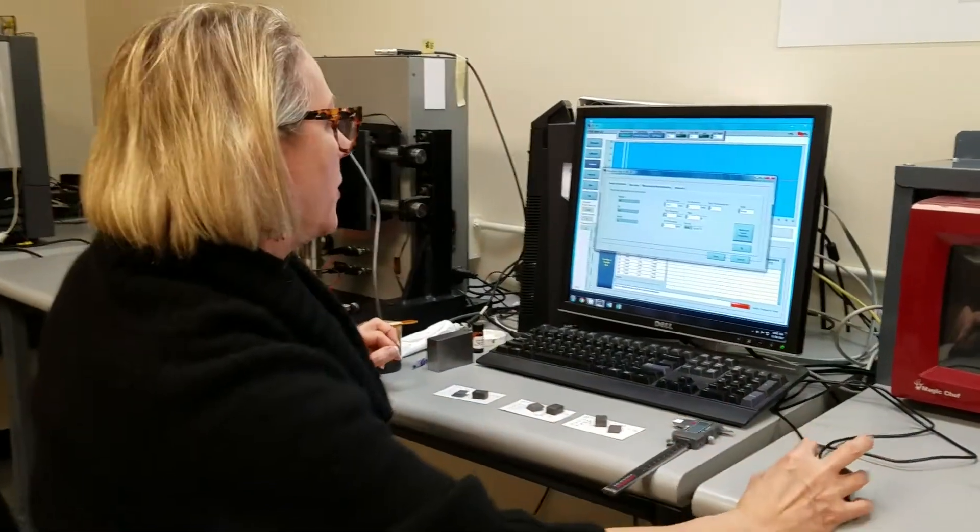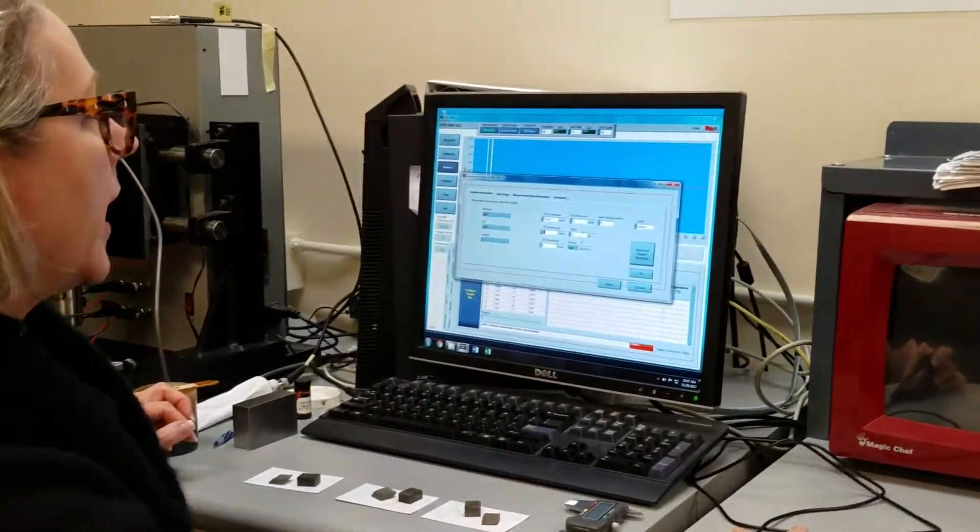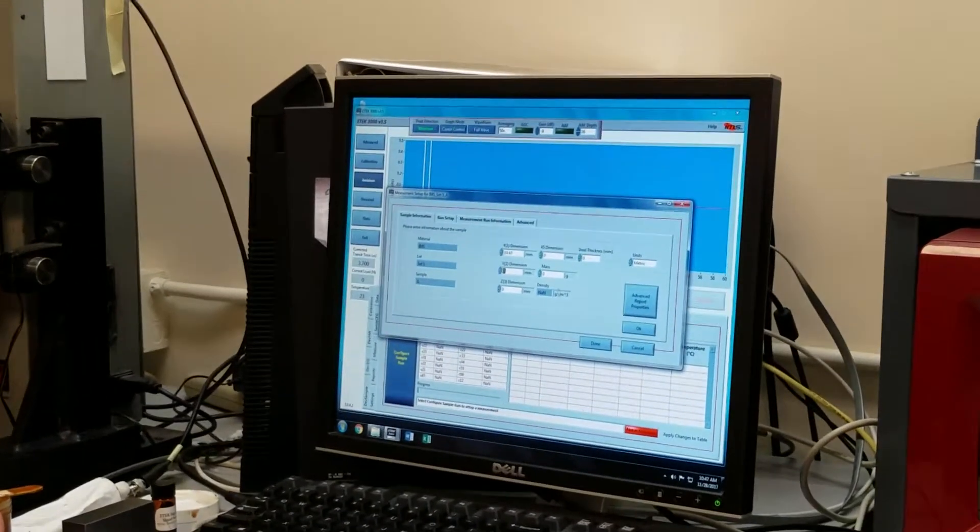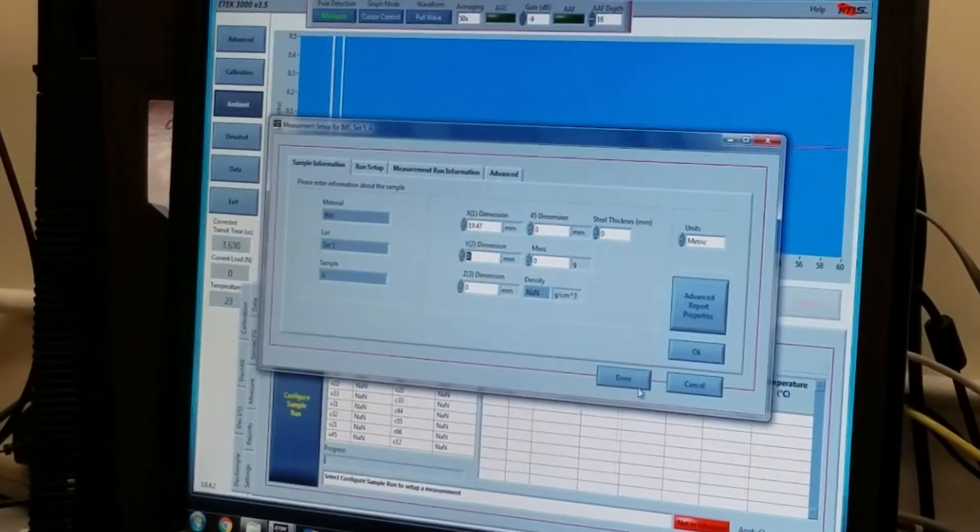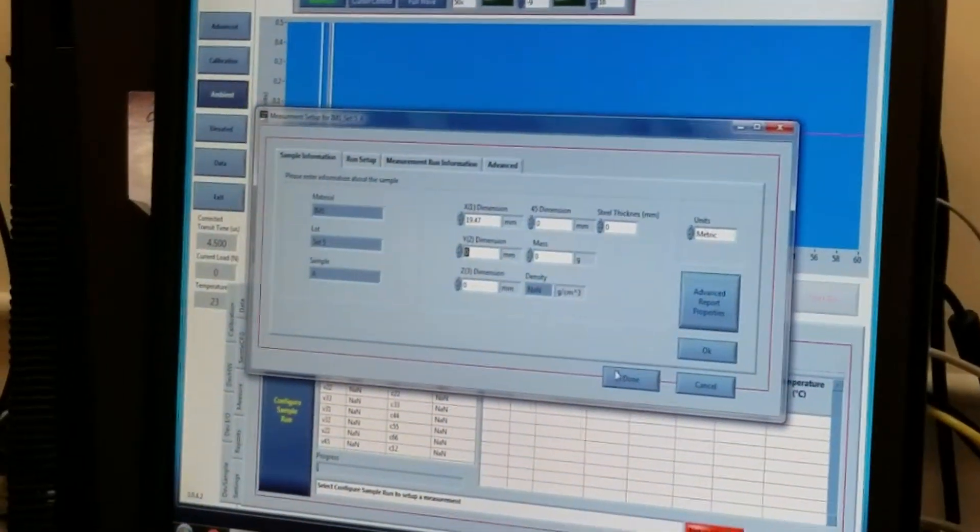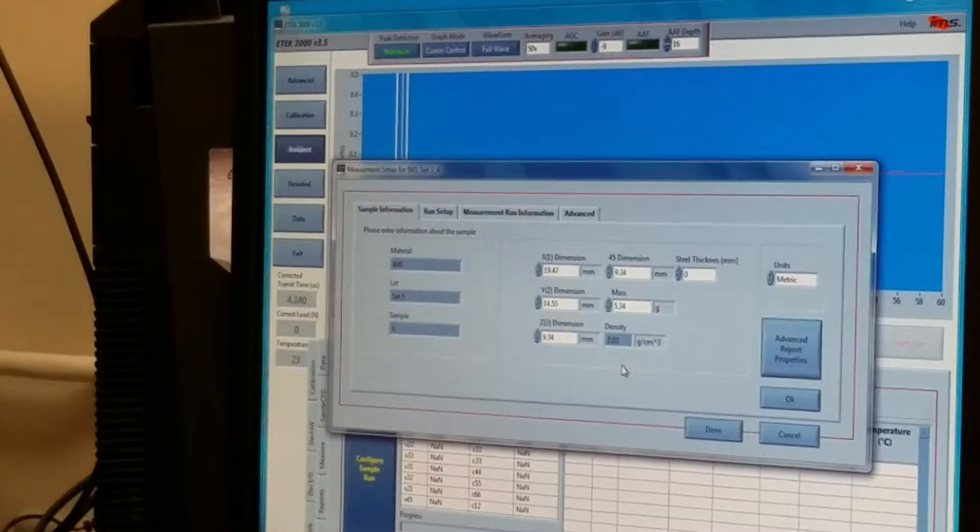Alright, so I will enter the dimensions and the weight, and when I'm finished, I will go on to the run setup.